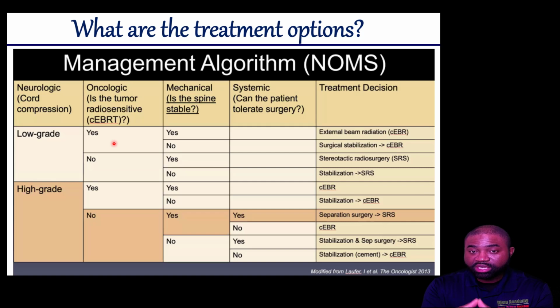If we cannot immobilize the patient, it automatically disqualifies the patient from receiving spinal radiosurgery. The mechanical stability of the spine is often one of the main goals when we do a comprehensive history and physical examination of every patient.